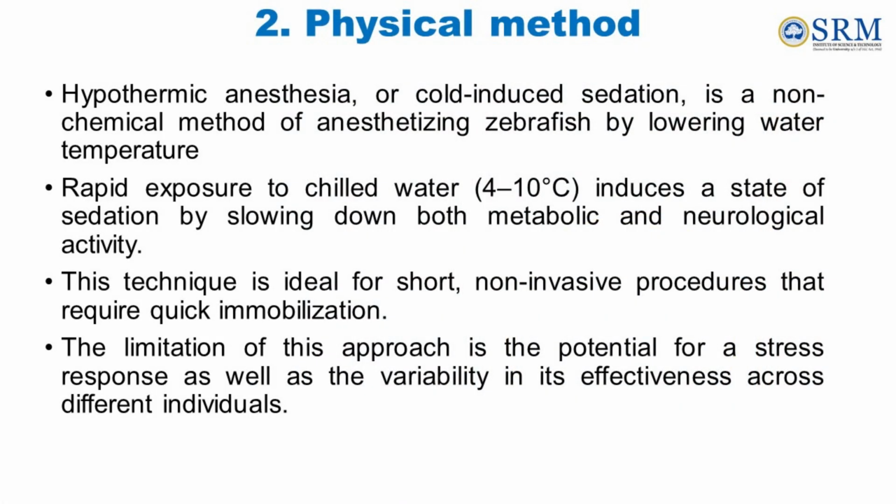Physical method. Hypothermic anesthesia or cold induced sedation is a non chemical method of anesthetizing zebrafish by lowering water temperature. Rapid exposure to chilled water, 4 to 10 degrees Celsius, induces a state of sedation by slowing down both metabolic and neurological activity. This technique is ideal for short, non invasive procedures that require quick immobilization.